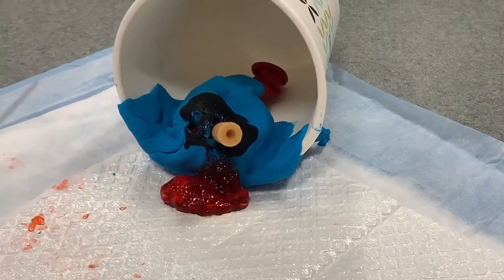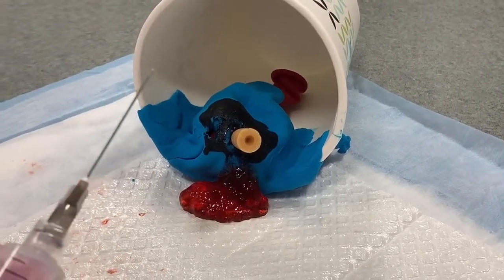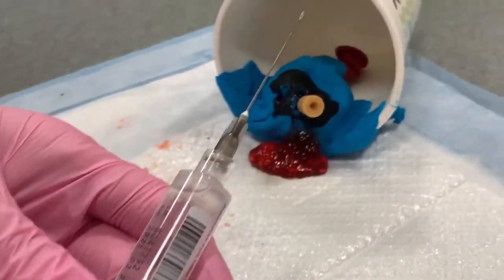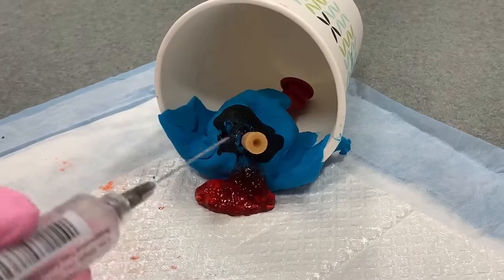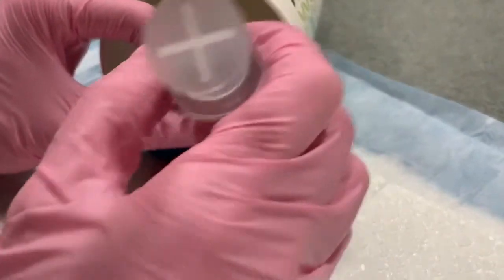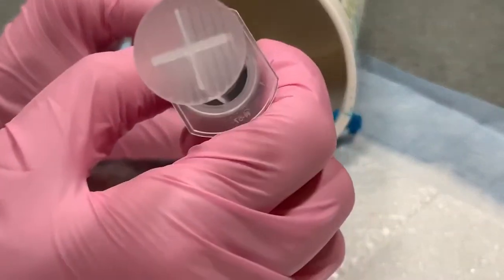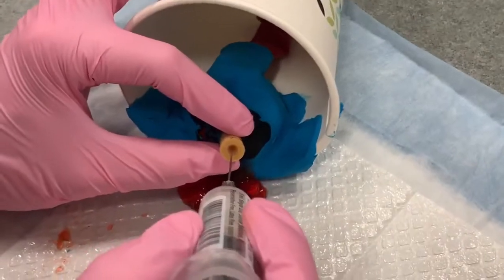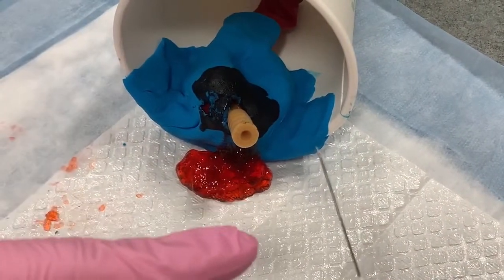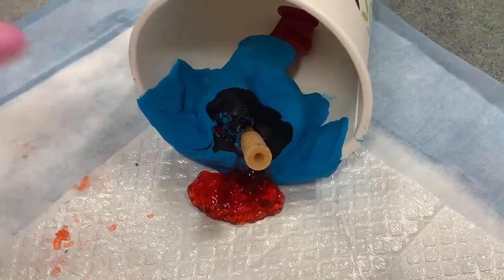Once it is in place, you will inject into the catheter about 3 milliliters of normal saline. This is using a 22 gauge 1.5 inch needle. The trick is that you want to place the needle directly into the middle of the Word catheter. Otherwise, you may puncture through the Word catheter and it will not be useful.